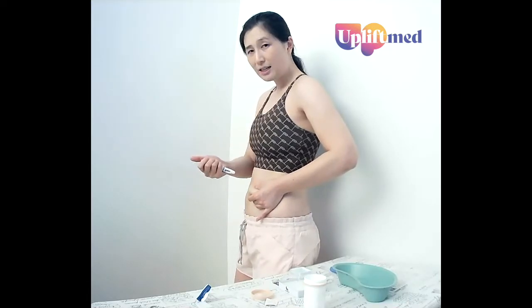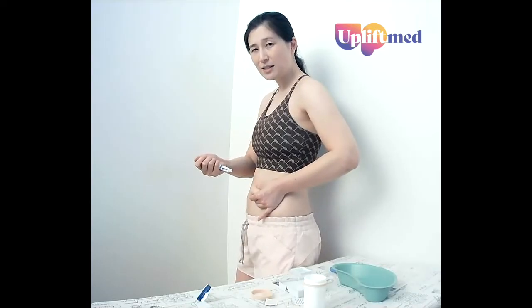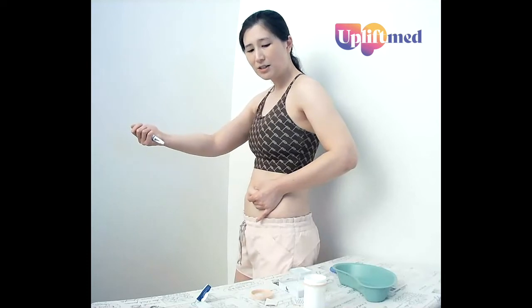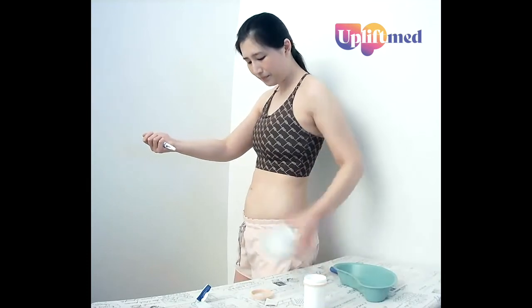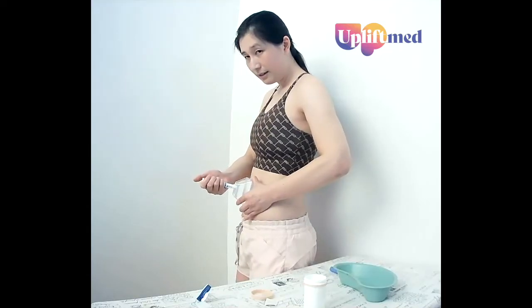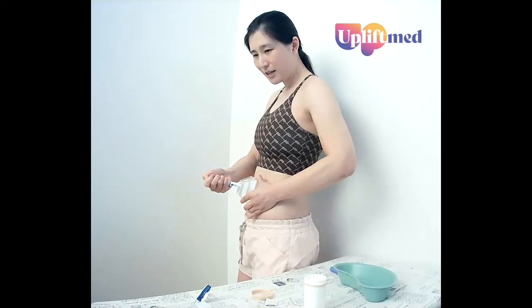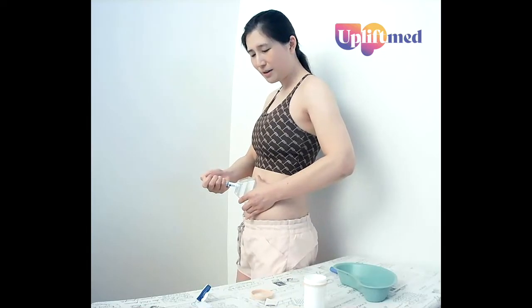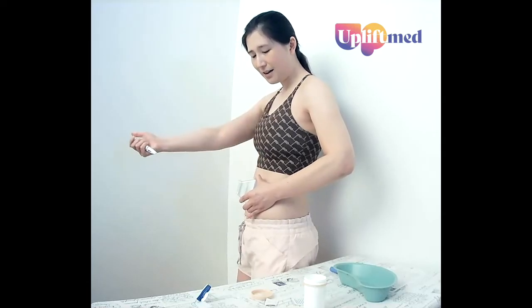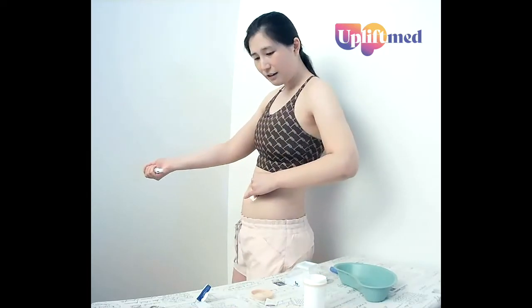So go in, press the button. Once it's finished clicking, count six Mississippis and then go out. Ready? Here we go. In — it's finished clicking — one Mississippi, two Mississippi, three Mississippi, four Mississippi, five Mississippi, six Mississippi, and out. Use our cotton ball for any fluid or blood.